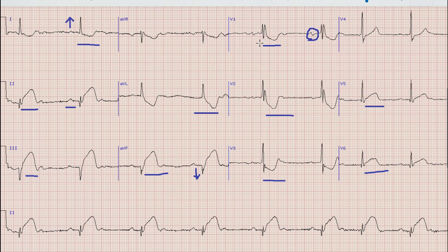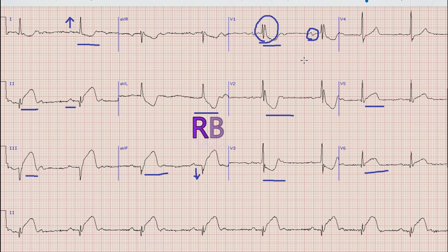Next, if you look at lead V1, there is an RSR' pattern with a prolonged QRS duration that is more than 3 small squares or 120 milliseconds, which means that there is right bundle branch block.